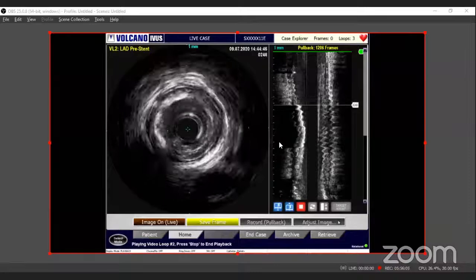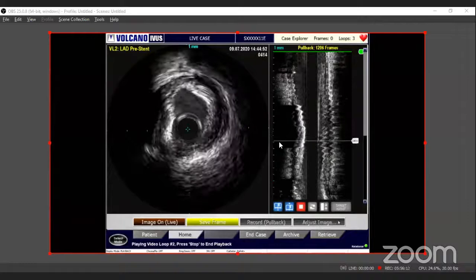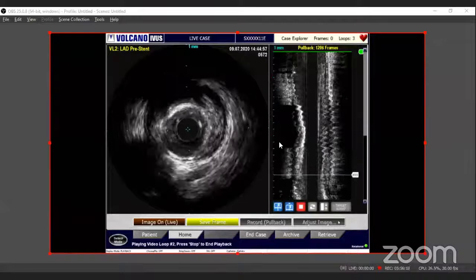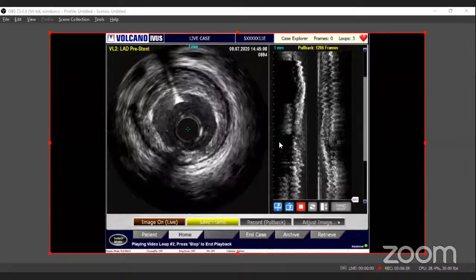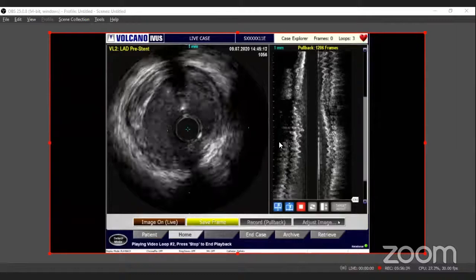So you see mostly fibrotic plaque. There's a little bit of calcium in the 9 o'clock region, but mostly fibrous. Coming to the ostium now of the LAD, you can see it starts to get tight just in the ostium of the LAD. So this is really a true bifurcation lesion, Medina 1,1,1. This is in the distal left main. The left main also has moderate amounts of plaque all the way back to the ostium as well. That's in the aorta. Yeah.